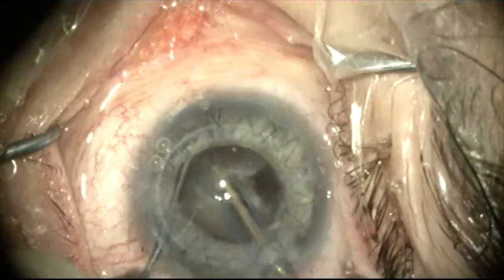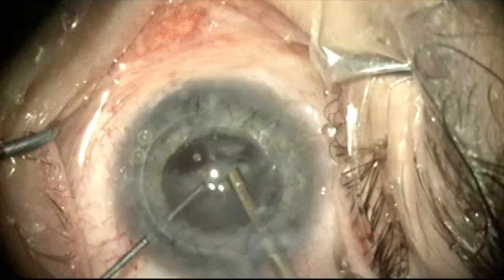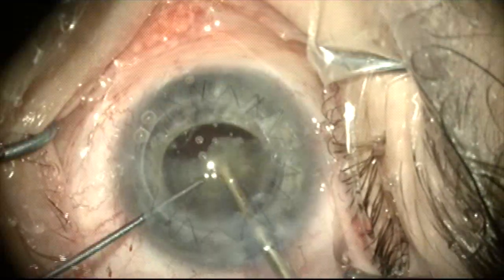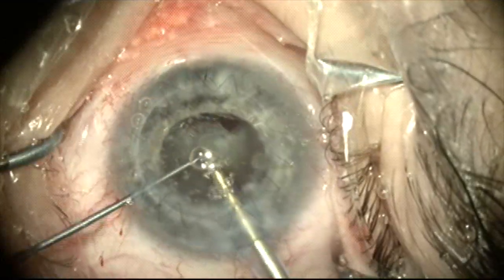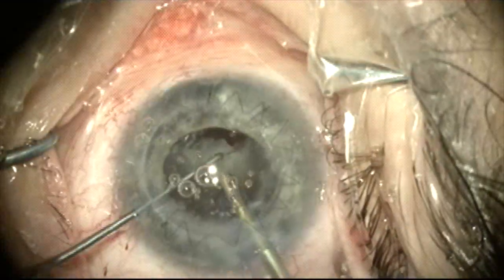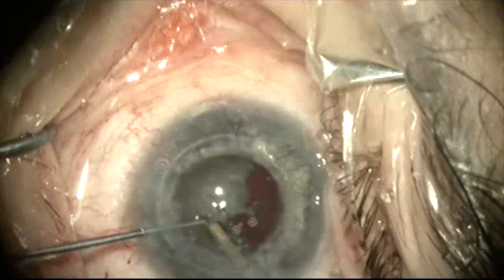The nucleus is rotated and another fragment sliced off, and this can be taken easily as well. This is a dense cataract but there's plenty of room here to work as this is a very large eye.